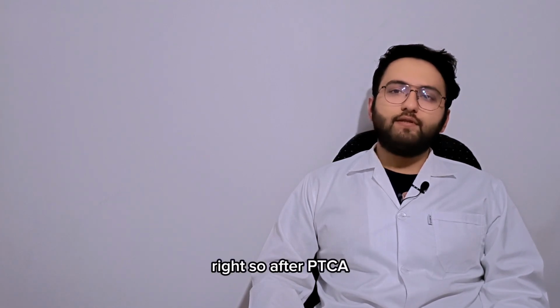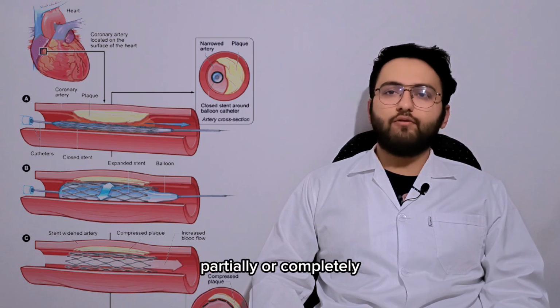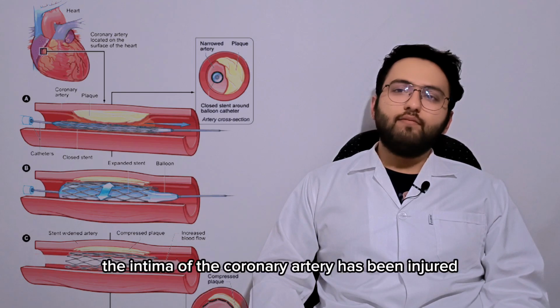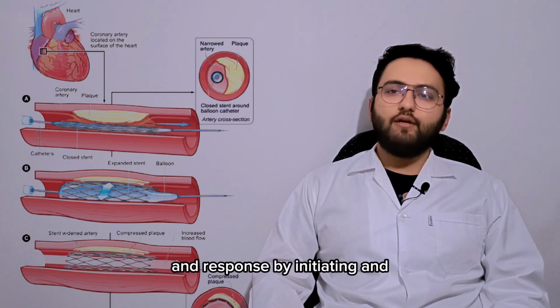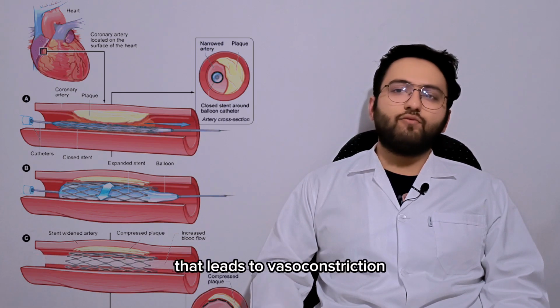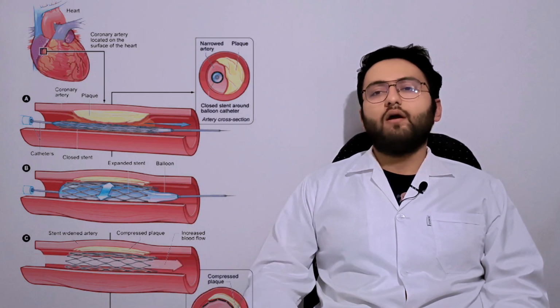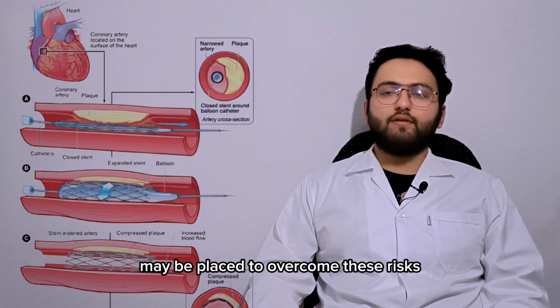Right, so after PTCA, the area that has been treated may close up partially or completely, a process called restenosis. The intima of the coronary artery has been injured and responds by initiating an acute inflammatory process. This process may include release of mediators that leads to vasoconstriction, clotting, and scar tissue formation. A coronary artery stent may be placed to overcome these risks.